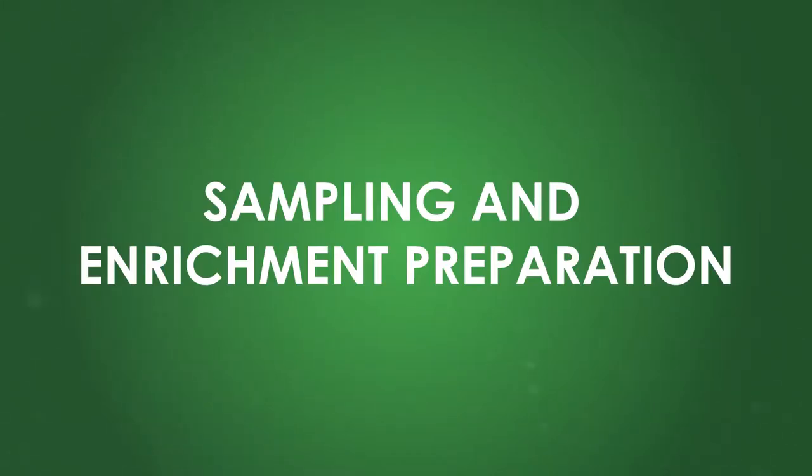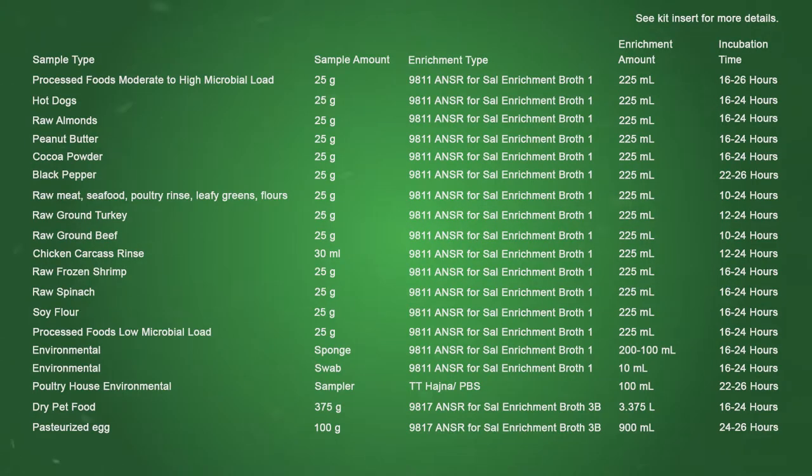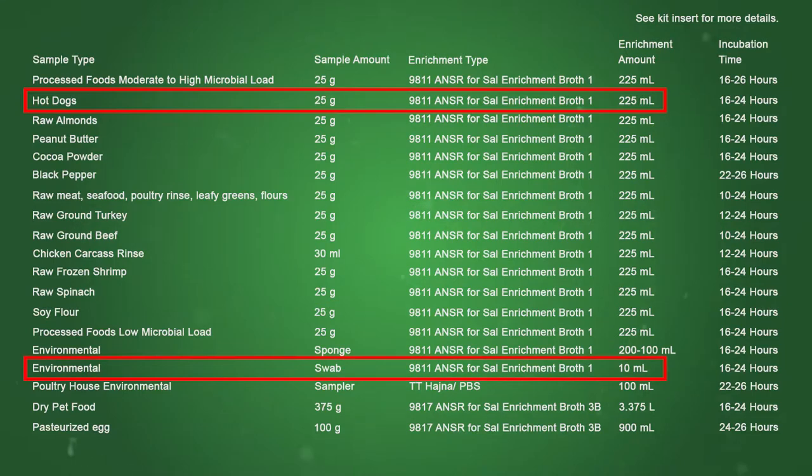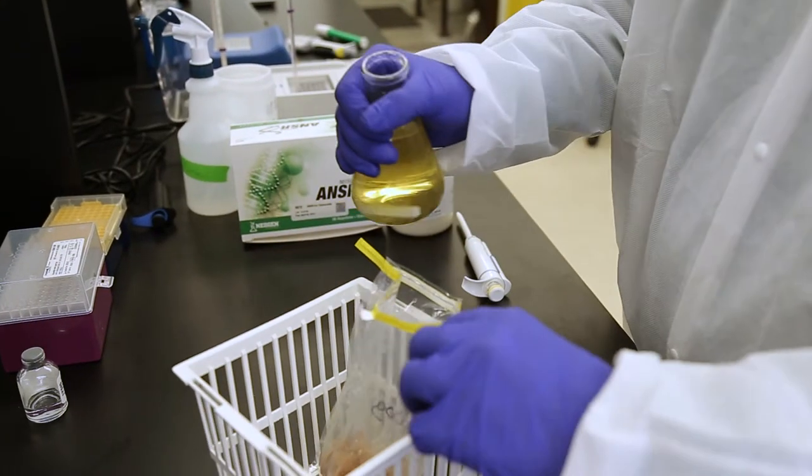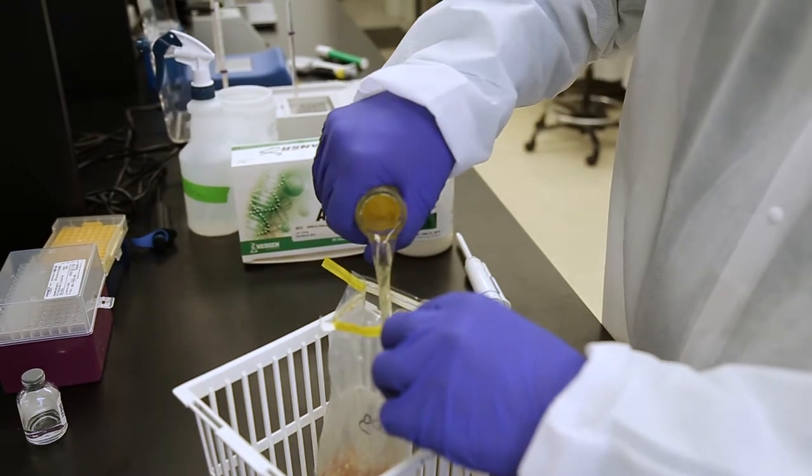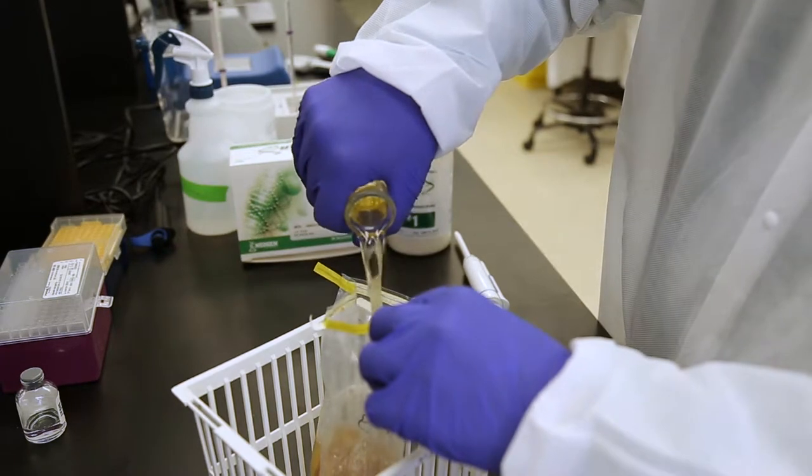Sampling and enrichment preparation. This video demonstrates the procedure using hot dogs and environmental samples with Neogen's Answer for Salmonella Enrichment Broth 1 media. Weigh out the appropriate amount of sample and rehydrated media into a sterile stomacher bag as seen in the chart.